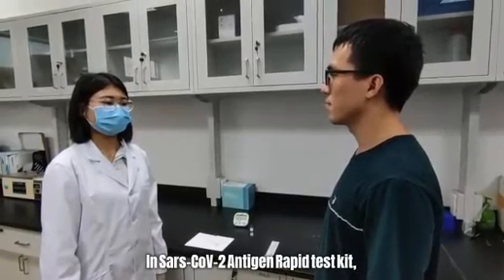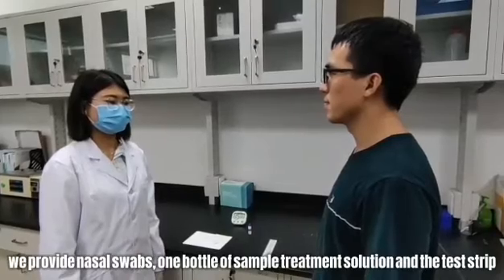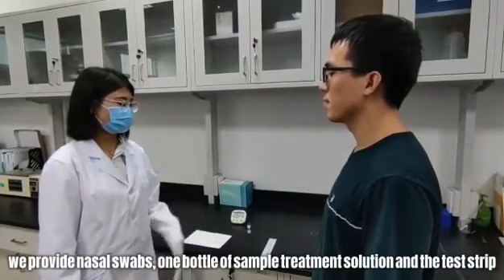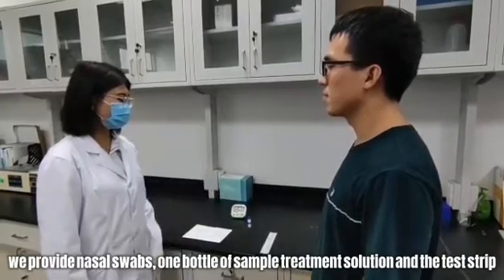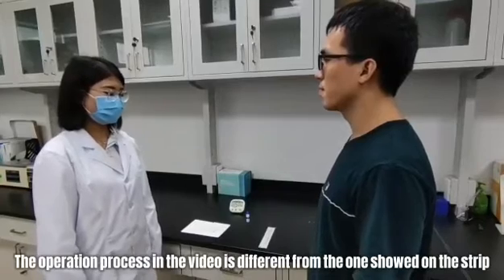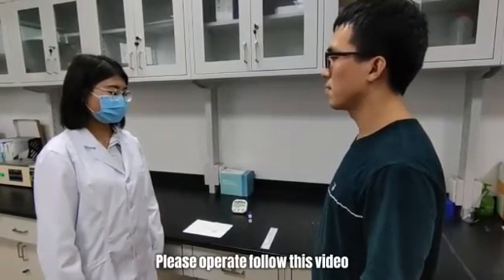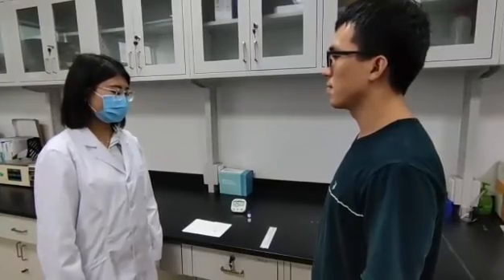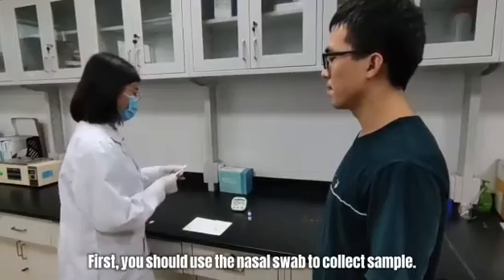In the SARS-CoV-2 antigen rapid test kit, we provide nasal swabs, 1 bottle of sample treatment solution, and a test strip. The operation process in this video is different from the one shown on the strip. Please follow this video. First, you should use the nasal swab to collect the sample.